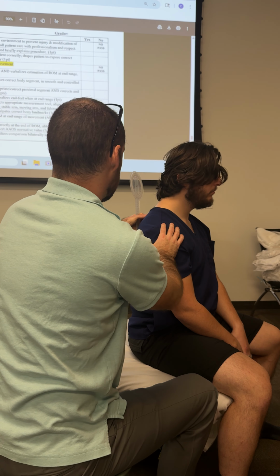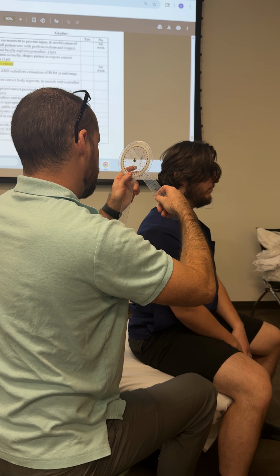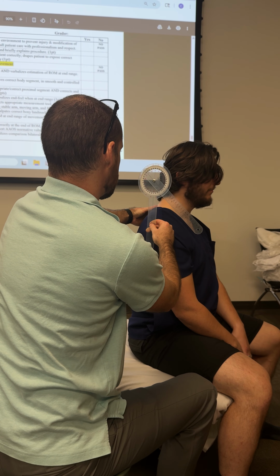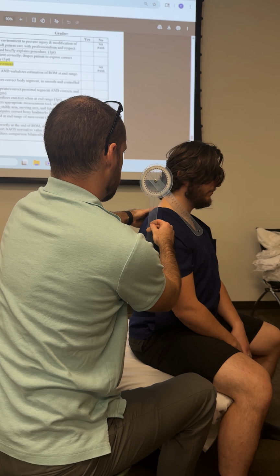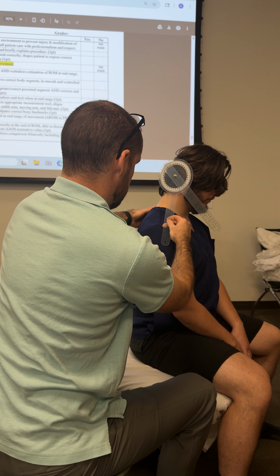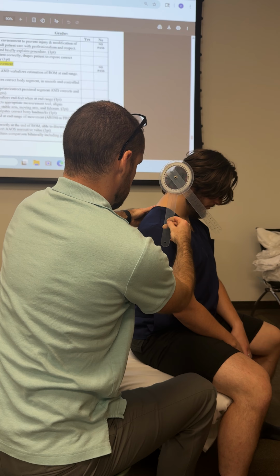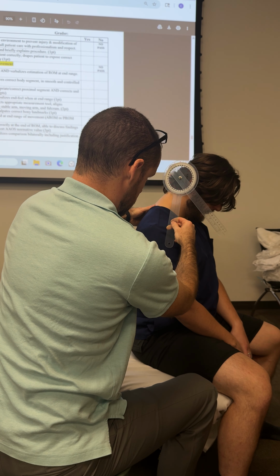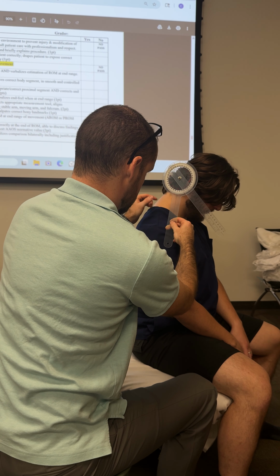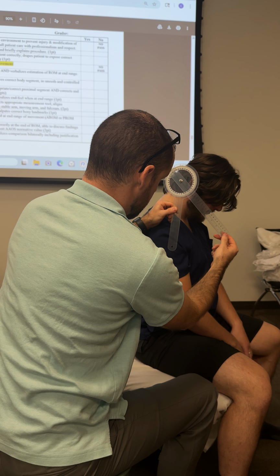Come on back up, look down one more time. Actually, let me preset my goniometer. So I'm going to go 45. I'm parallel to his trunk. Go ahead and come down. The hair's getting in the way, but I can do it. Go, go, go, go. Right there, stop, come back up, ever so slightly. Right there. And yeah, he's right about at 45.